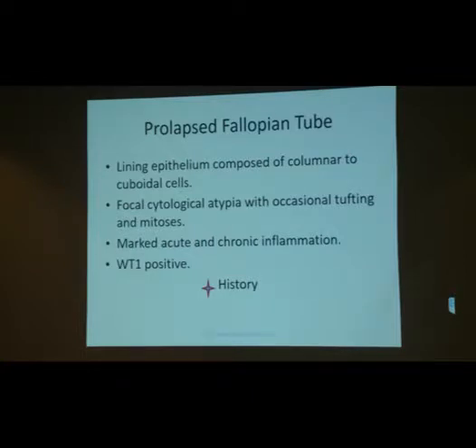Why should we bear it in mind? Because in the vagina, there's a limited number of conditions which can cause adenocarcinoma. And it's kind of rare in the vagina. I'm not saying it doesn't occur, but it is kind of rare. So we must bear it in mind and remember that it can look atypical. And of course, history is pretty vital.